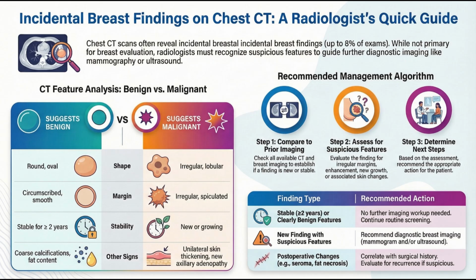It does. And here's the final thought for you to take away. As our imaging technology gets better and better, should these mandatory notifications expand? Should a finding on a high-resolution scan like CT trigger the same conversation about density as a mammogram? Or is the complexity of managing all these incidental findings just too high outside of that dedicated breast imaging world? The technology is definitely ahead of the policy right now. And that's something for all of us to mull over.